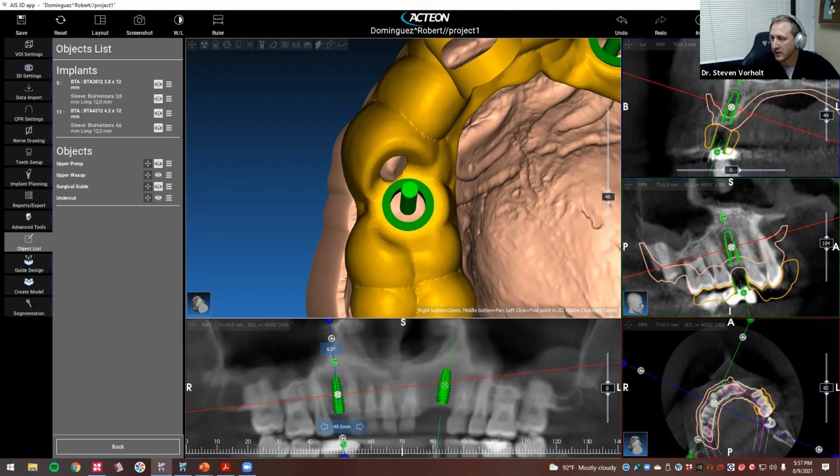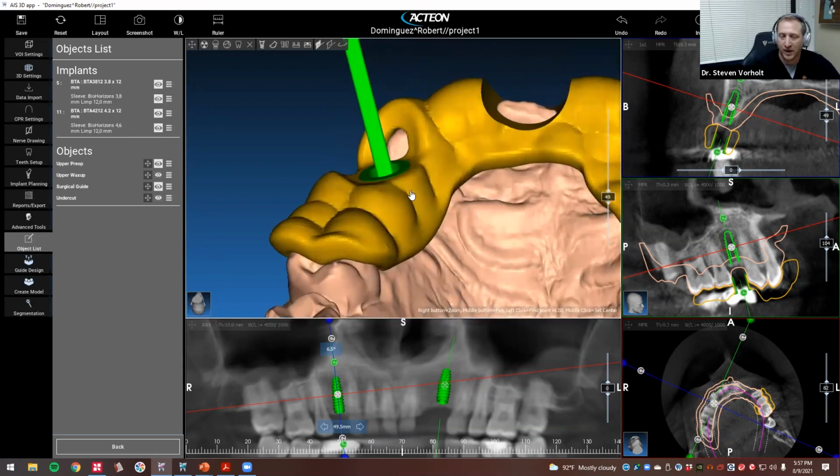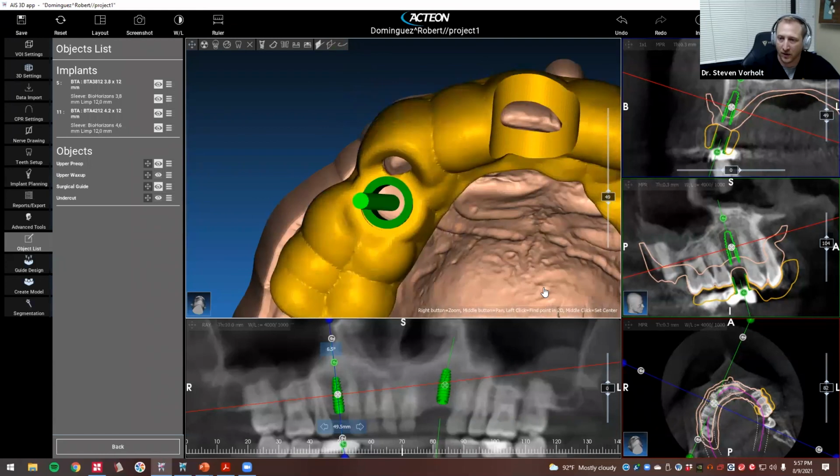What else do we got here? Do you insert the drill sleeve before or after curing the surgical guide? I do it before. I found that if you wait till it's been cured, it's a lot harder, and you then have to ream out the inside of the guide sleeve portion. So I'll do it right after it's been washed, after it's come out of the isopropyl wash system. I'll go ahead and put that in. It goes in pretty easy.